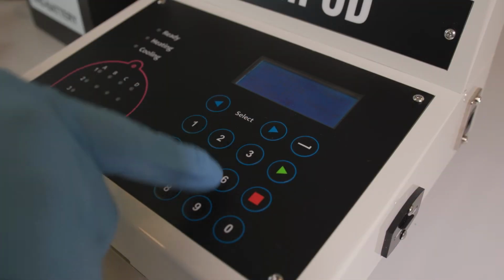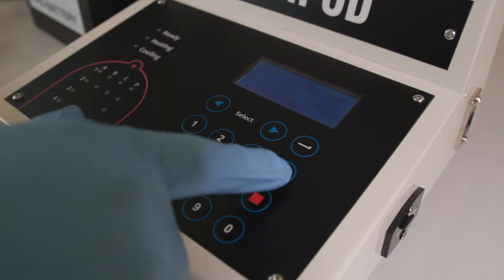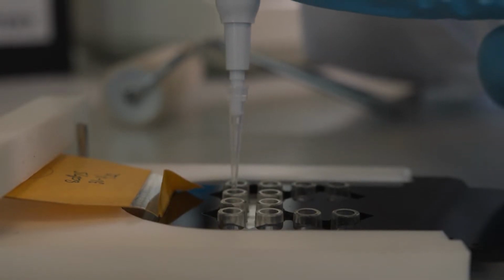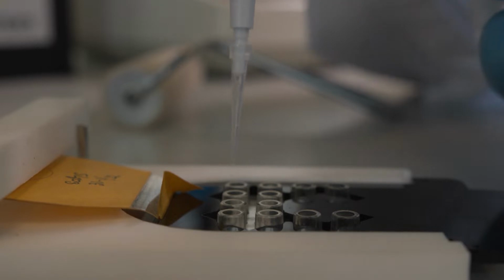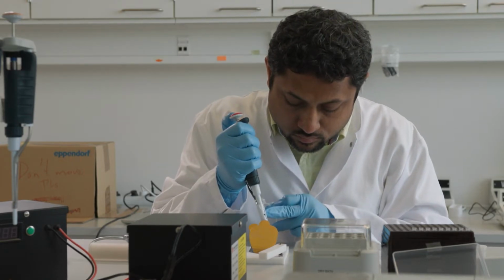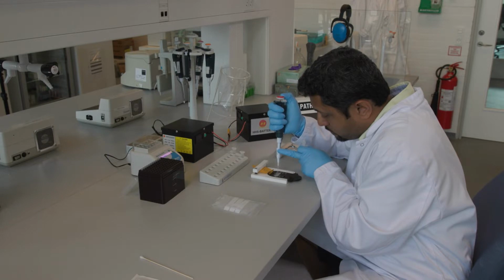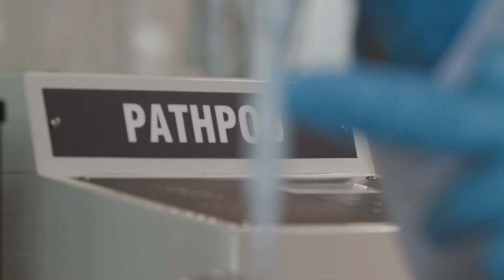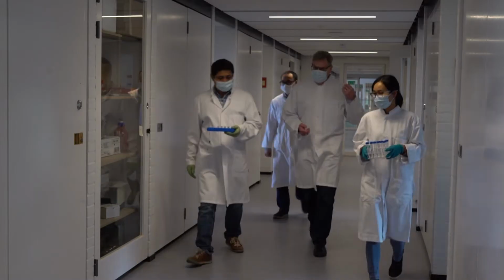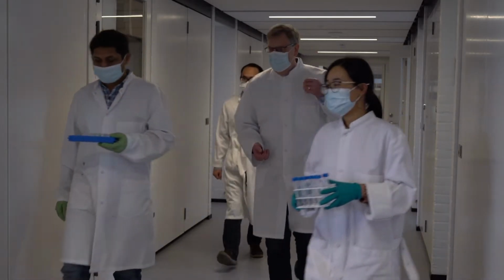In the fight against the COVID-19 pandemic, this portable device could be crucial. Using lab-on-a-chip technology, it's able to detect positive cases on the spot. The testing system has the accuracy of a molecular test and the speed of an antigen kit without the use of a laboratory. It's called PathPod and is being developed in Denmark as part of a European project that includes researchers from Italy, Austria, Sweden and China.